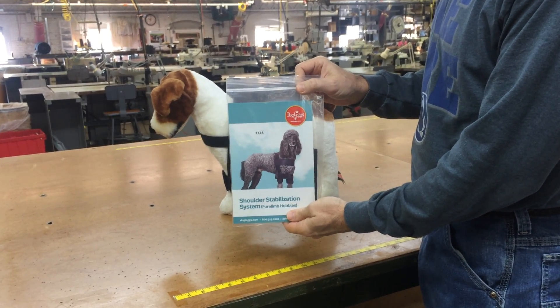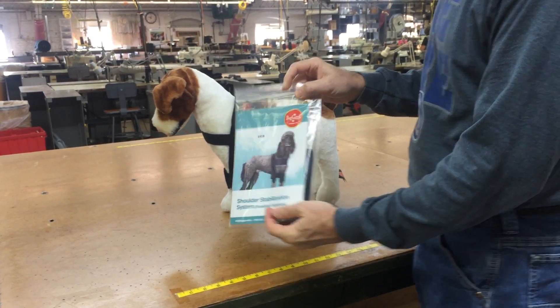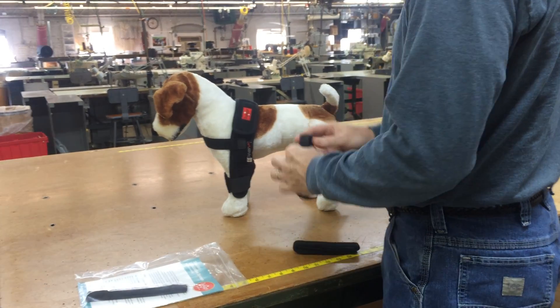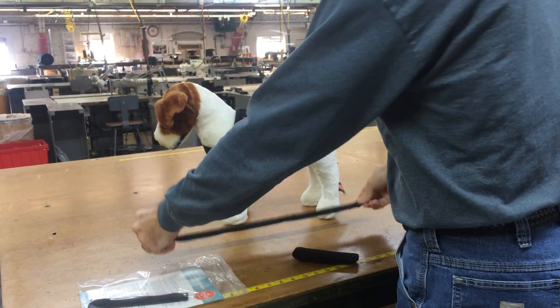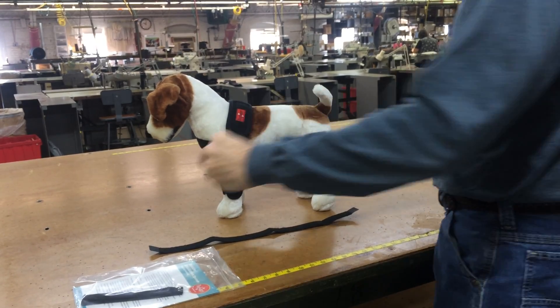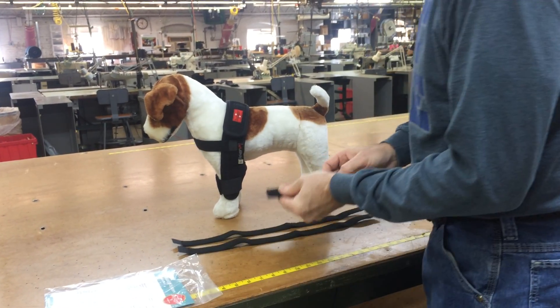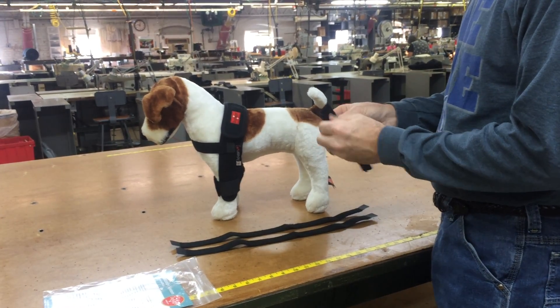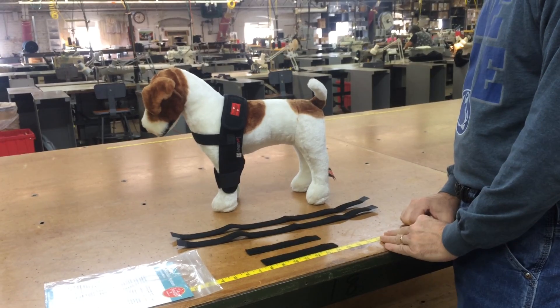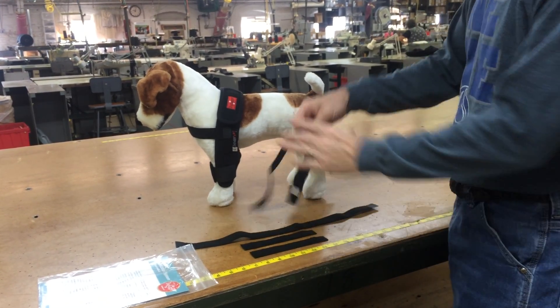This video demonstrates how to properly fit the Dog Legs Shoulder Stabilization System. Each product comes with two hobble straps — the longer straps — and two hobble tabs, which are the shorter straps. The Shoulder Stabilization System uses one hobble strap and two hobble tabs. The second hobble strap is an extra strap.